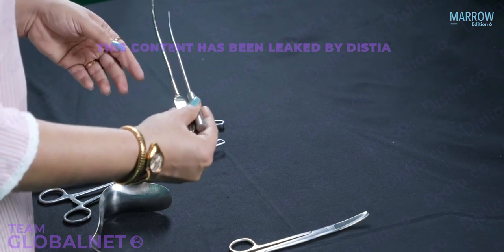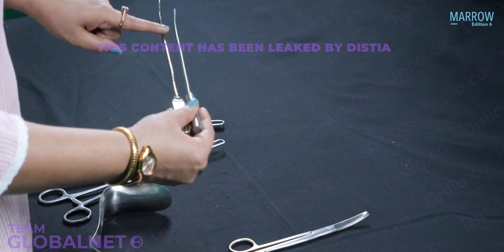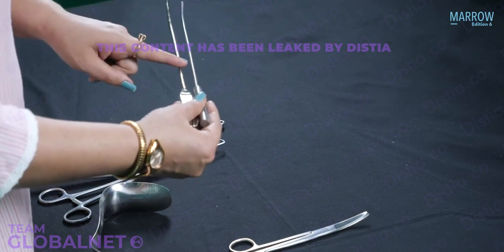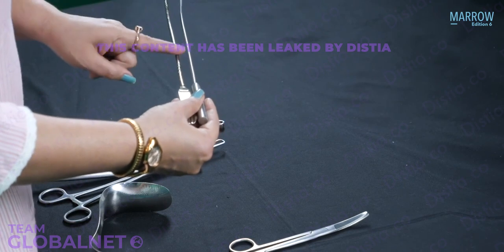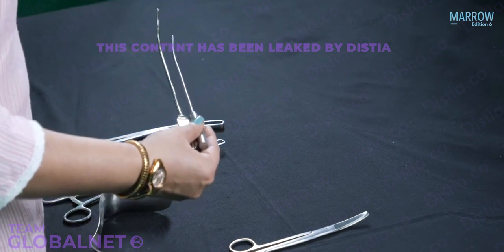So look over here very carefully. The sound which has got an angle like this. Can you see a very sharp angle? Yes. So the sound which has got an angle like this is the uterine sound, number one.